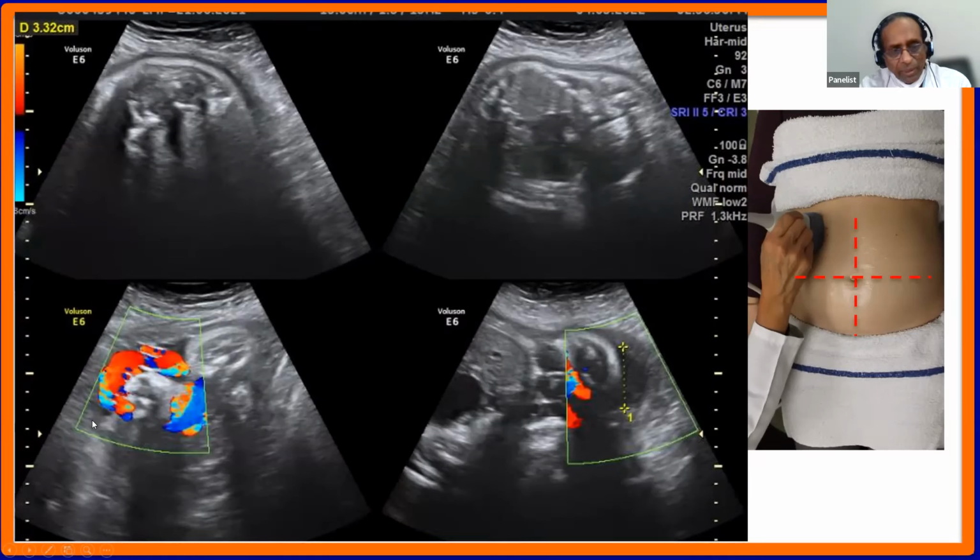So measure the pockets in four quadrants, and you add. Maximum pocket is the pocket that has the most fluid. Actually, this is more indicative of oligohydramnios and avoids unnecessary interventions. If you use the maximum vertical pool versus the AFI, maximum vertical pool is actually better. Now, you need to keep in mind that to get the maximum vertical pool, you have to scan the uterus in all four quadrants. So you're looking at amniotic fluid evaluation anyway. But as I said, it's simpler to use the single deepest pool.